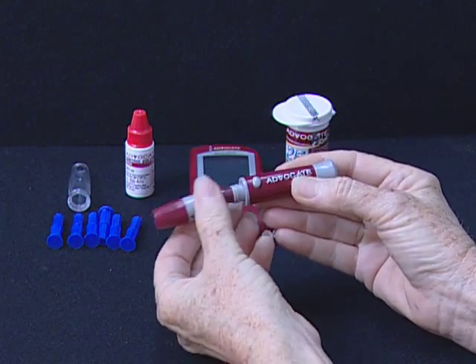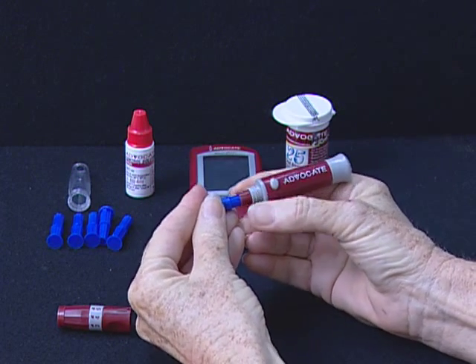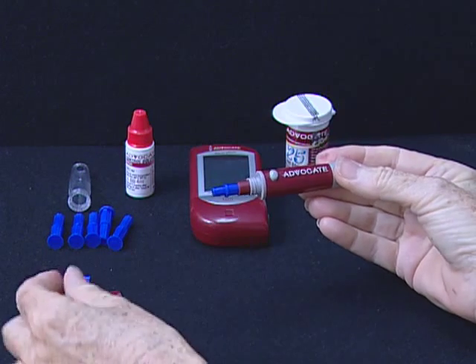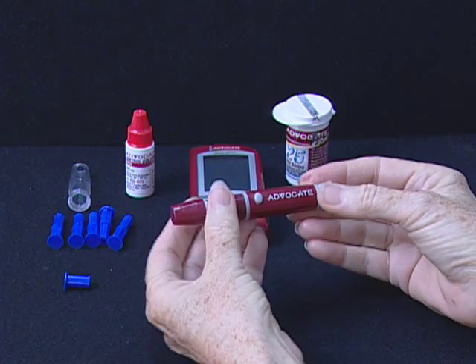Screw off the cap of the lancing device. Insert a lancet into the lancet holder and push down firmly until it is fully seated. Twist the protective disc until it separates from the lancet. Replace the lancet device cap.